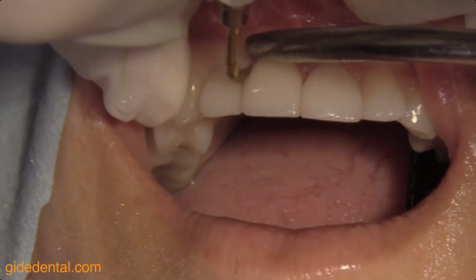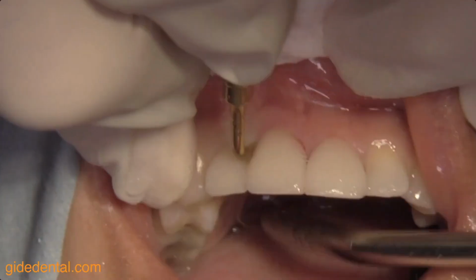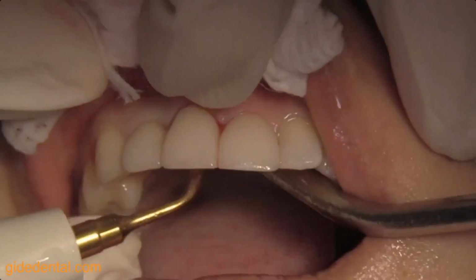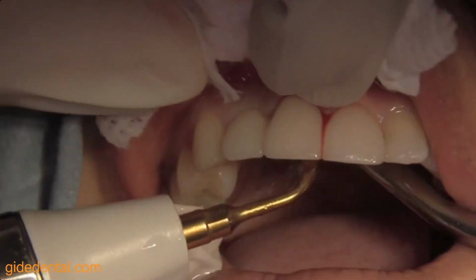Careful, I don't want to jeopardize any bone. So this will really go into the spacing between the teeth. Checking if there's already some looseness. Then loosening from the palate.